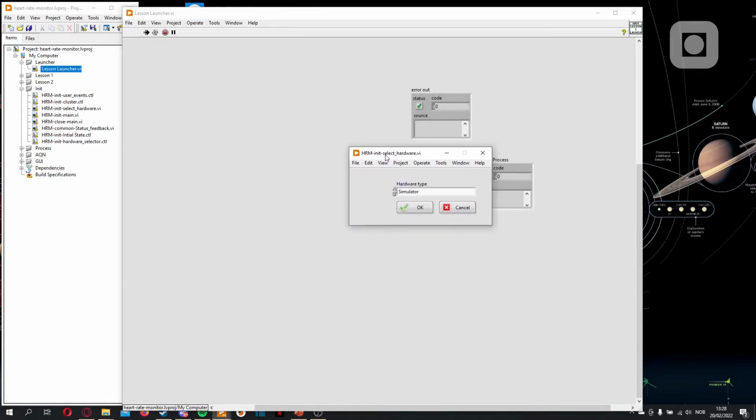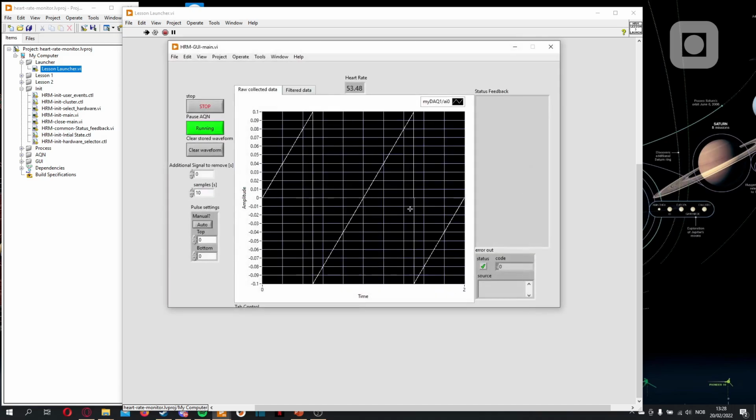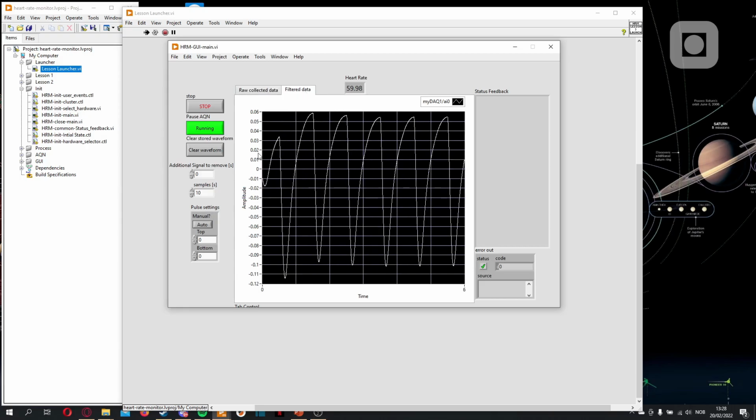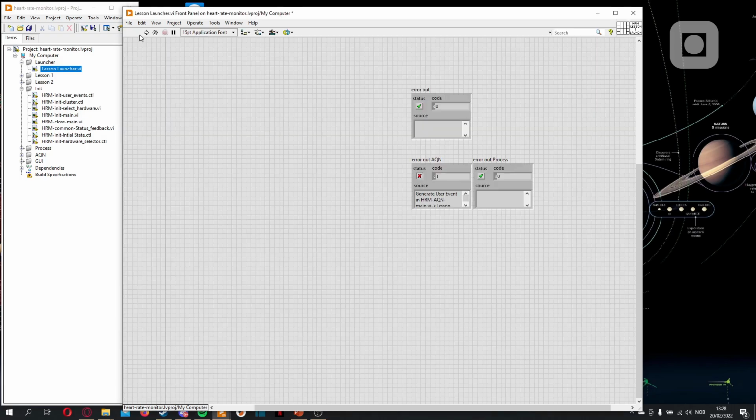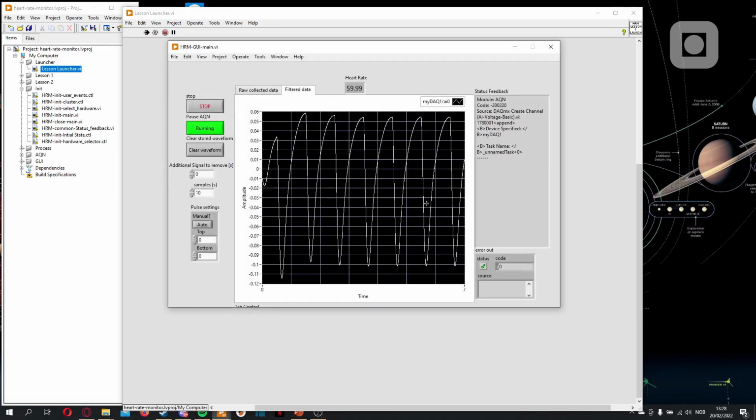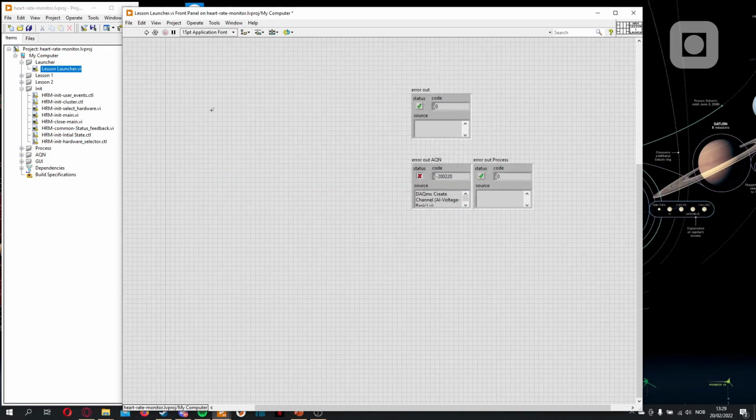So which do you want? We want the simulator. Okay, and here we get it. I don't have my MyDAC connected, so we can try with the MyDAC, and then we get an error. So it works as intended. We still haven't added anything else to the other ones, but that's fine.